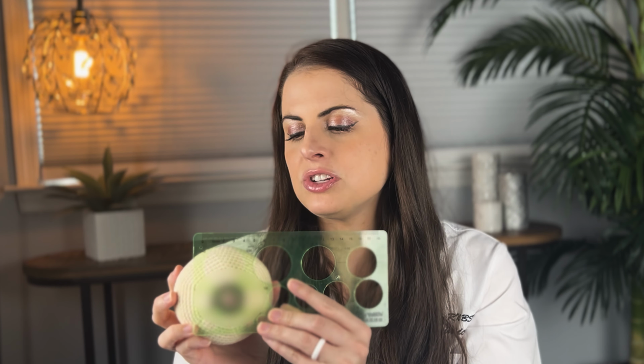You're just going to see which circle fits your nipple best without any areola going into the pump. I have some other great tips for you when it comes to using your breast flange.